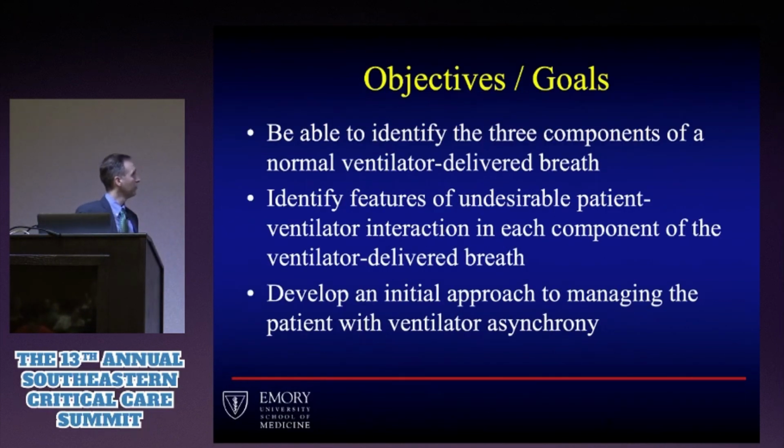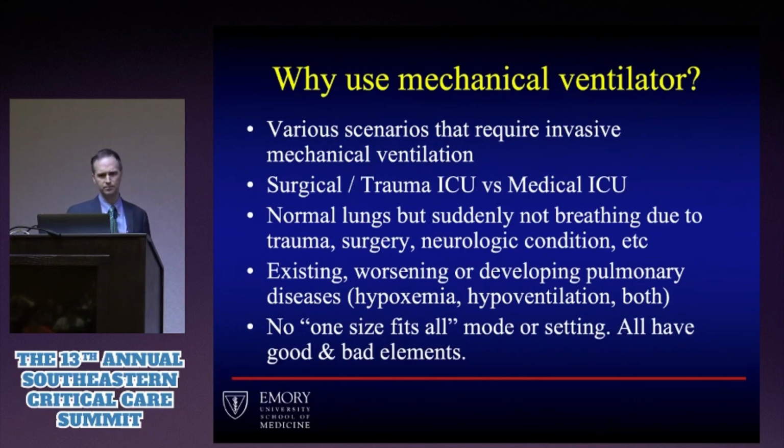So I want to go through the ability to identify what the normal waveform should look like, because if you don't know what they should look like, then you can't identify when they look incorrect. And then we'll identify features of undesirable patient-ventilator interaction, which we'll call dissynchrony, with each component of the ventilator-delivered breath, and then develop an initial approach maybe to managing that asynchrony.